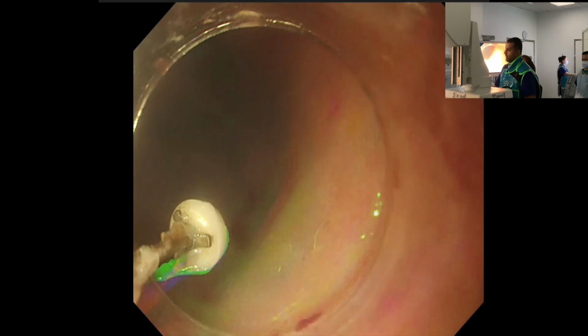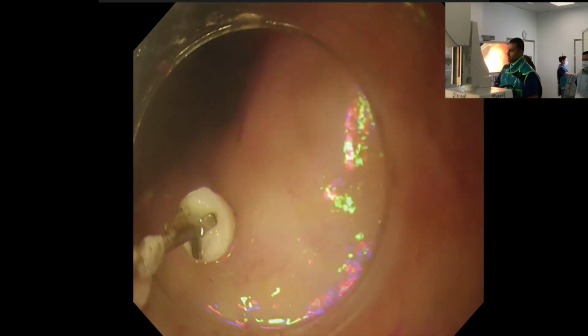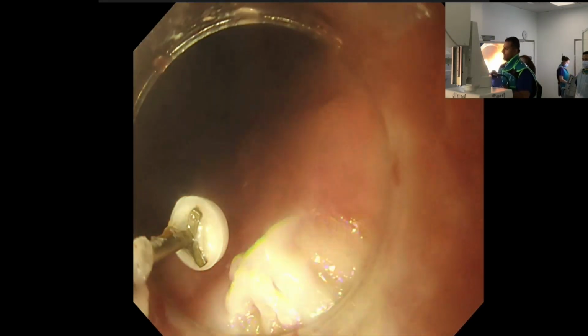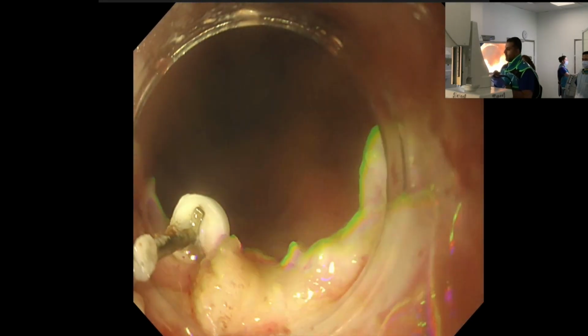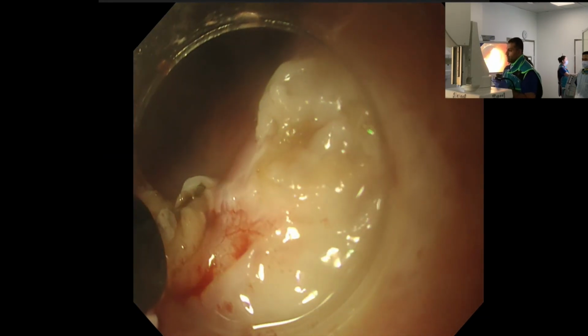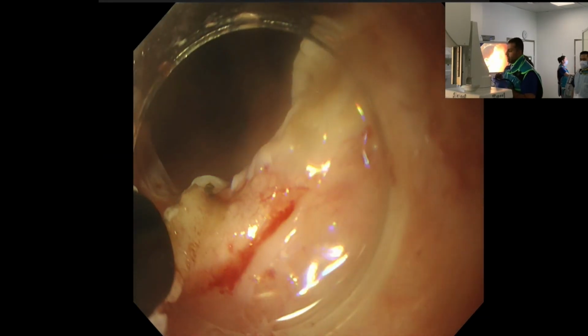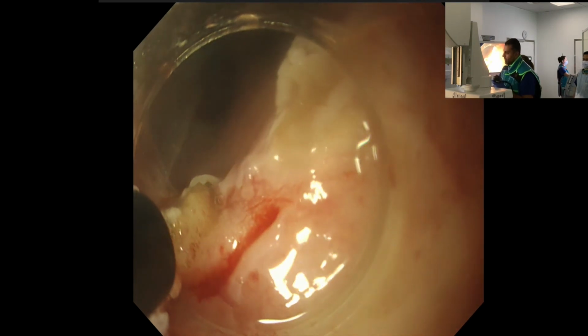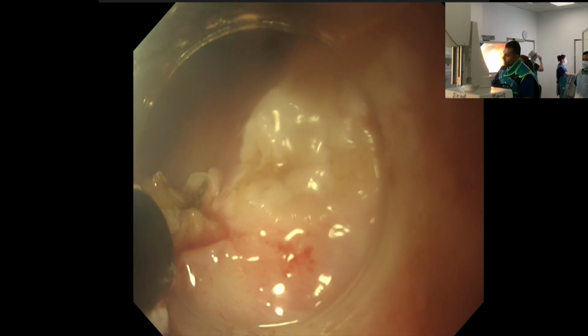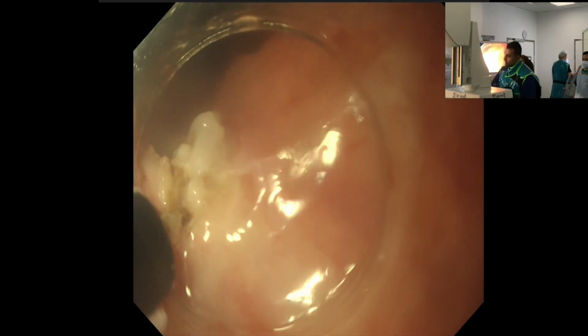Some people will ask, do you need a pre-injection with this? Not really, because you want to try and get down to that sort of connective tissue layer. So here I'm just going to push the knife out a little bit more, you can begin to see the circular muscle fibers, the longitudinal muscle fibers beginning to appear, which is exactly what we want. And what I want to do is obliterate this ridge completely.